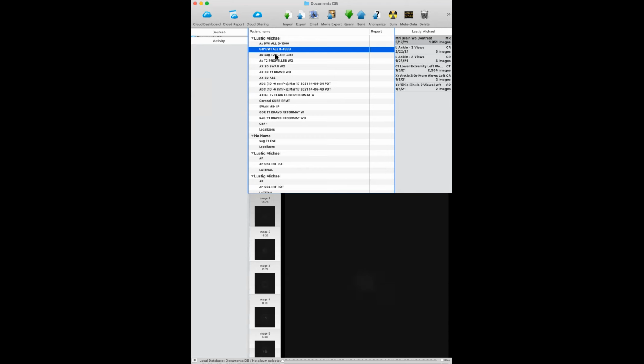If you remember echoplanar imaging, it's basically reading k-space in a single shot, very, very fast. And when you do that, what artifacts may you actually get, if you remember? Do you remember? Was it in that Shepp-Logan phantom with the ghosting?